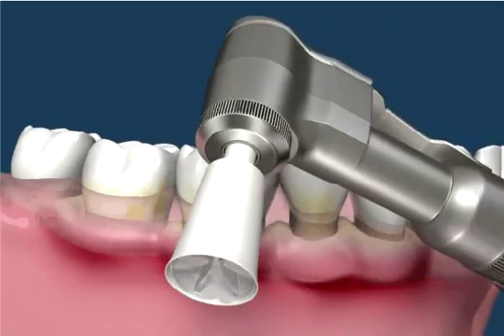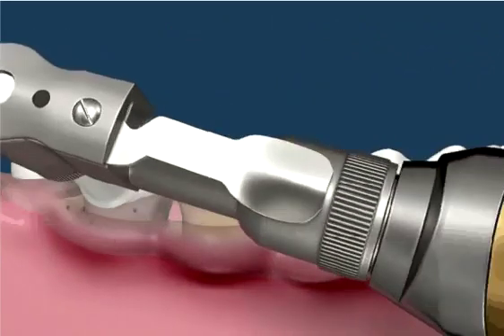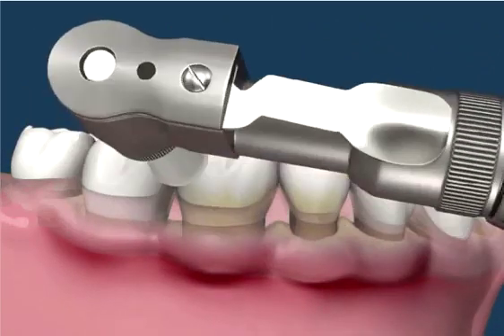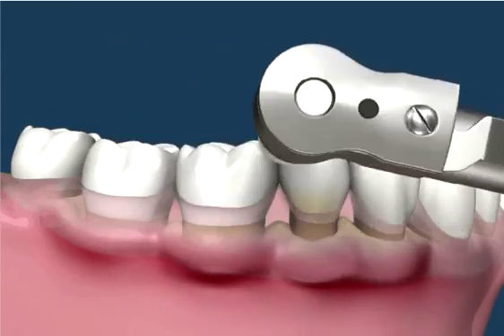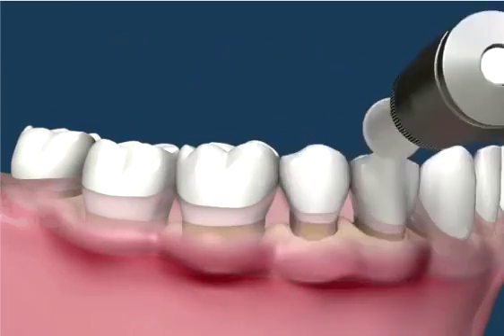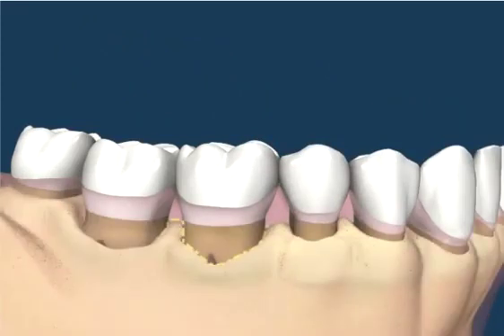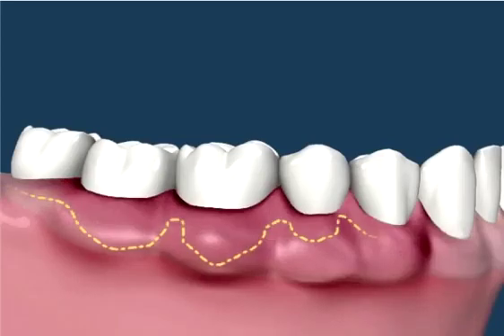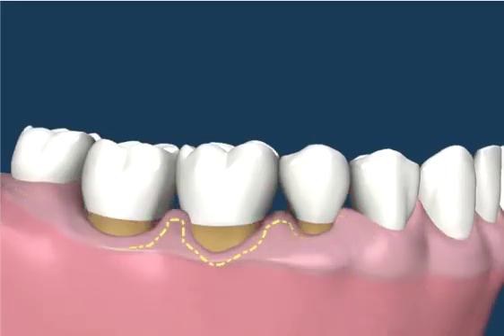Finally, the teeth can be polished with a rubber cup and an abrasive paste. It will be used to remove debris and stains from above and below the gums. With the calculus gone, the irritating factors will have been removed and the tissue will get back to health. With bone loss, however, the healthy gums will follow the new receded bone levels and may create recession around the teeth.